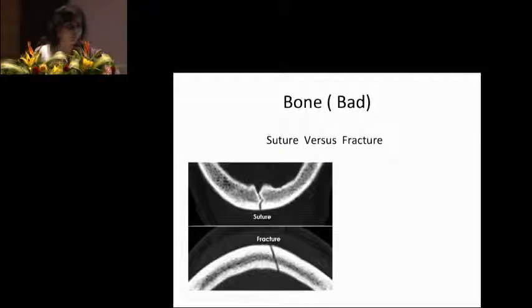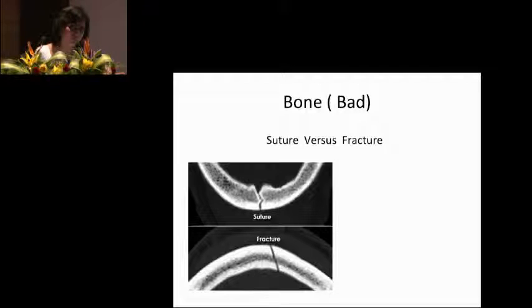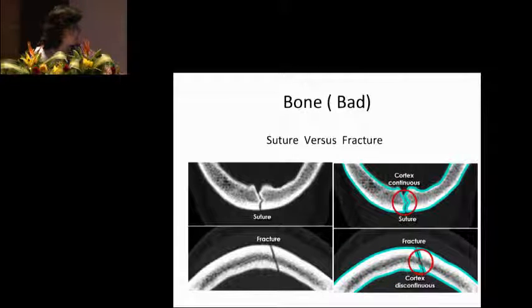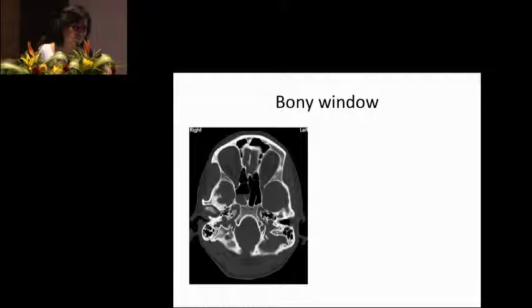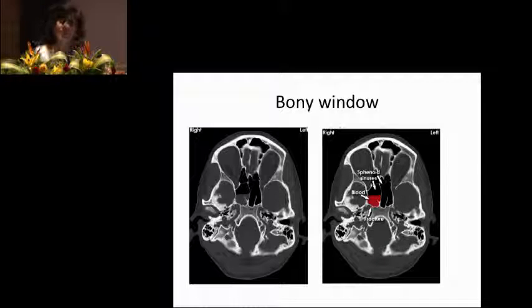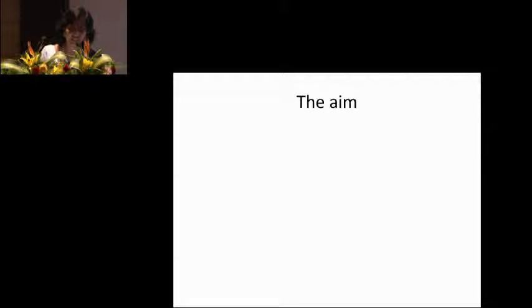B is also for bones — you're looking for fractures. How do you differentiate a fracture in the bone from a suture? It's simple: with a suture, the cortex stays continuous, whereas it is discontinuous in a fracture. A bony window will help you see this. If there is blood here, it may be because of a fracture of the base of the skull.